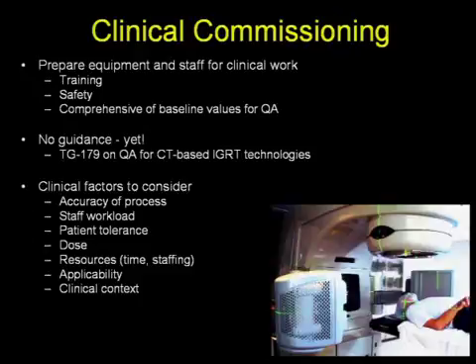When going through clinical commissioning, there certainly are clinical factors to consider, again in a multidisciplinary environment. The physicians would be well advised to tell the physicist and the therapist what is the expected accuracy of the image guidance process for a particular clinical process. One may think, for instance, that SBRT treatments may require stringent tolerances in terms of geometric discrepancies, whereas an AP/PA breast might have a different outlook on the accuracy.